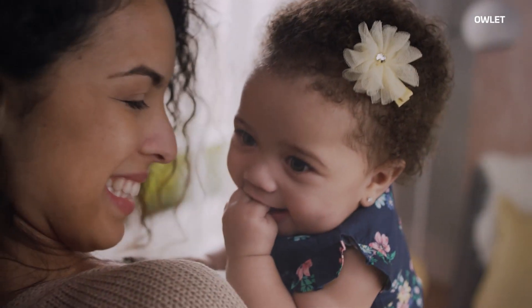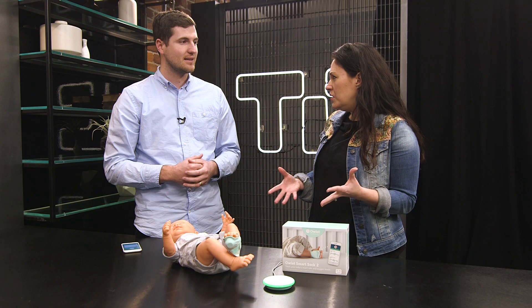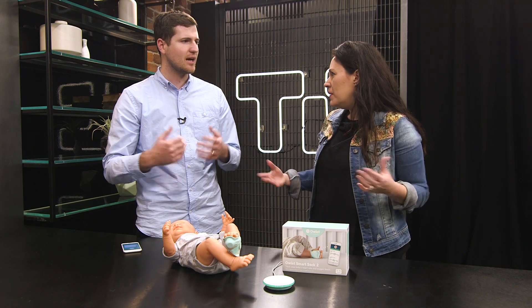Babies don't always cry when something's wrong, right? Like there might be a reason why you need to be woken up. And if you're a deep sleeper, to have something that's tracking your baby's heart rate every two seconds allows you to be in the know. That's our mission — to give parents the right information at the right time.